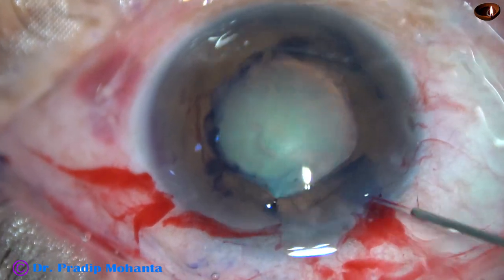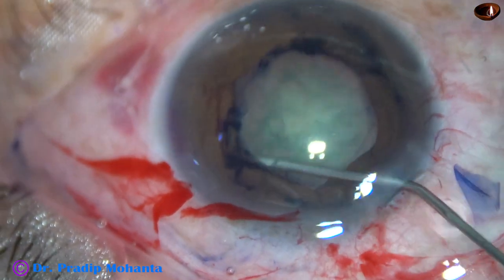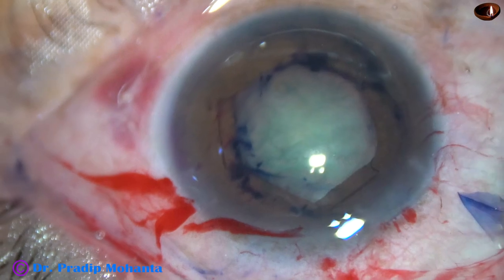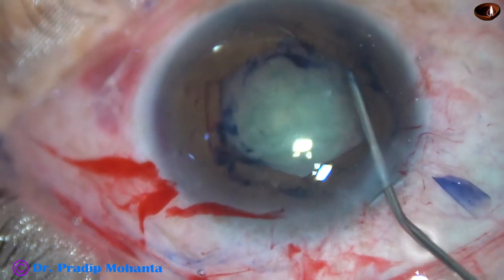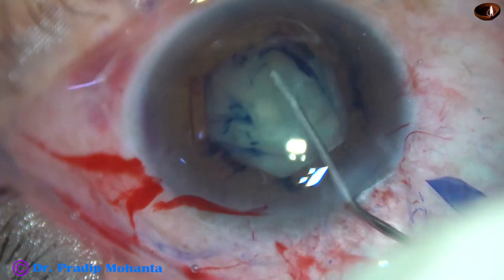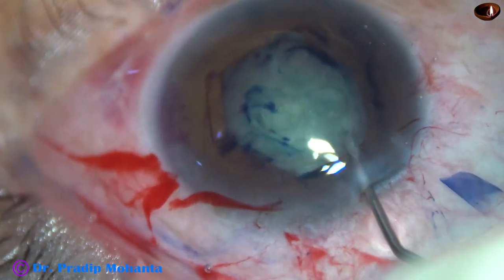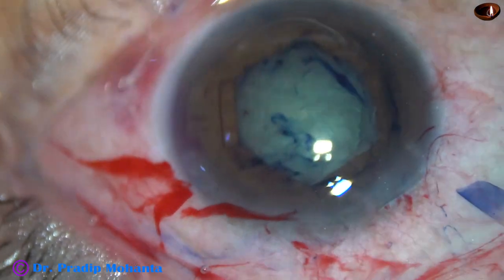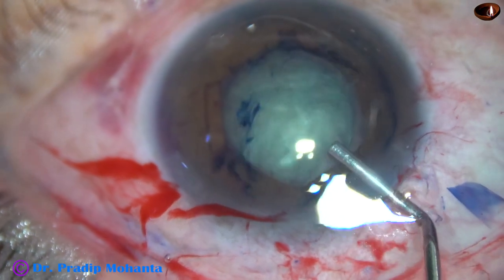And now hydrodissection. This is being done with a 27-gauge cannula. Hydrodissection has been done nicely. The nucleus is depressed and then the nucleus is rotated. And now visco is injected.